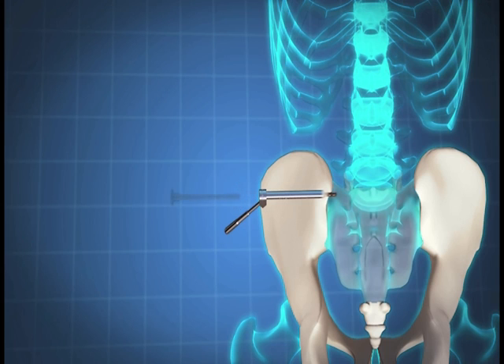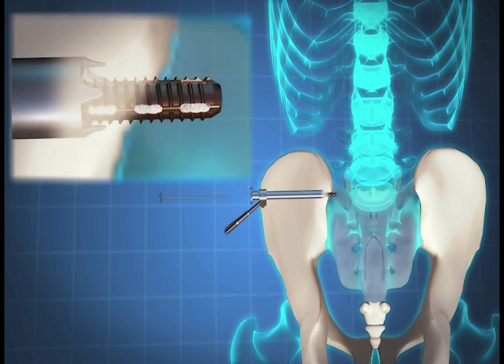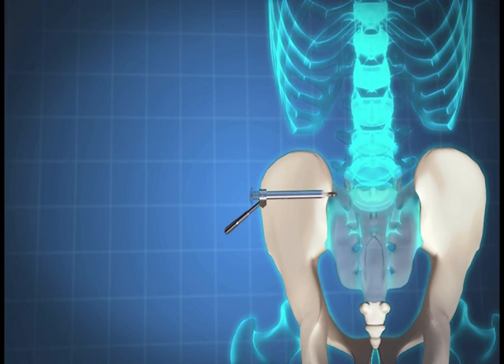At the surgeon's discretion, the packing plunger assembly may be placed into the drill guide to dispense additional demineralized allograft bone into the implant and or sacroiliac joint. Place the parallel guide assembly, which had been set for the distance between successive screws, into the drill guide. The second Samba screw entry point should be on a plane just anterior to the spinal canal at a level just below the S1 neuroforamen.